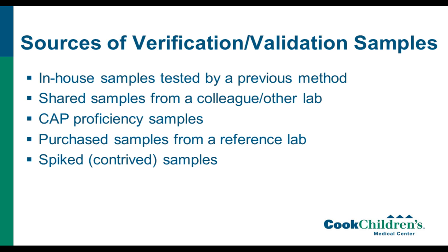You can also share samples between labs or between colleagues. So I frequently, if I want to validate something we don't have, or it's a new transport media, et cetera, I'll shoot my colleagues an email and ask if they have specimens they can share. You can also use CAP proficiency samples. Some of the reference labs will actually sell samples, so once they're past their storage date, you can purchase them and they will give you the values to do that. So we've done that in the past.